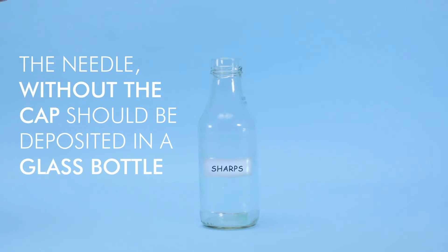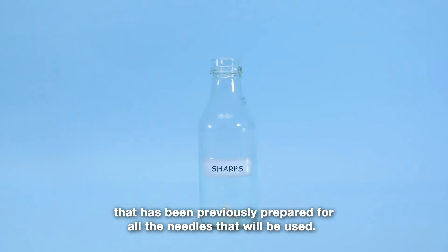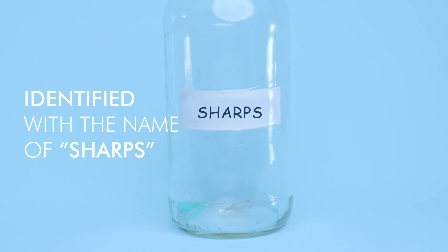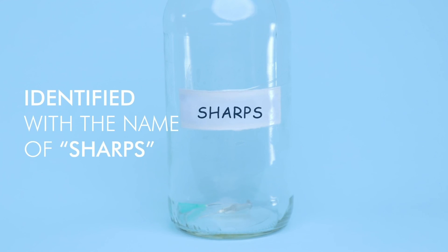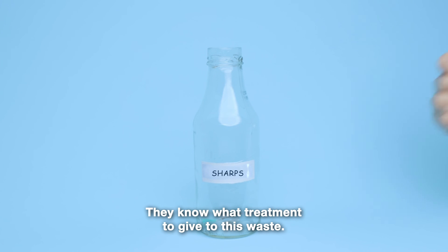The needle without the cap should be deposited in a glass bottle that has been previously prepared for all the needles that will be used. This is so that at the end of the treatment, this bottle is identified with the name of sharps, and when delivered to the personnel that collects the garbage, they know what treatment to give this waste.